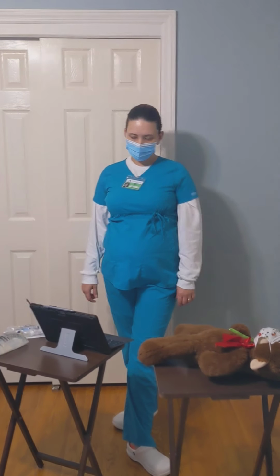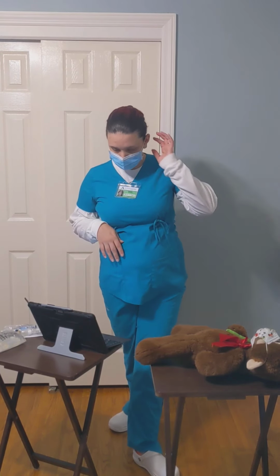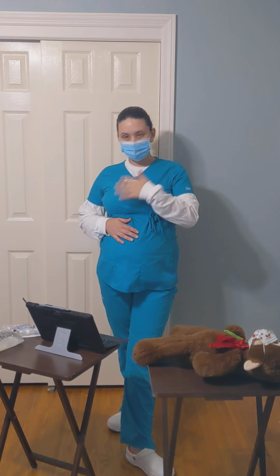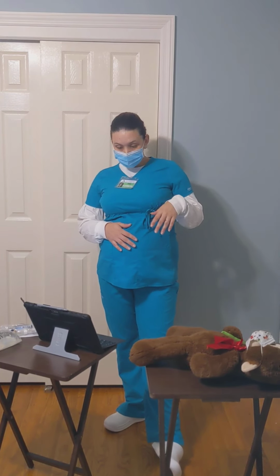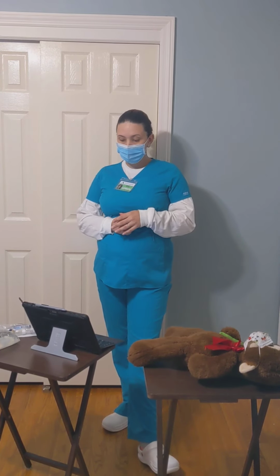So we're going to be doing the IV antibiotic administration skills video. Our patient is Mrs. Nagel, who's presenting to the ED with signs and symptoms of a postoperative infection. So she has an order for Zosyn, 3.375 grams and 100 mLs to be infused over 4 hours.